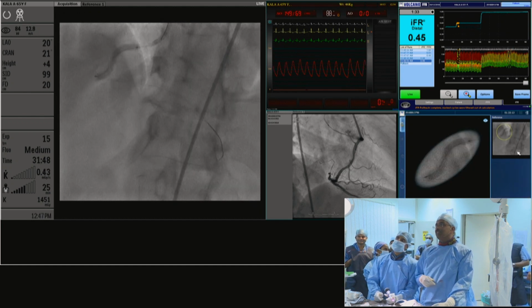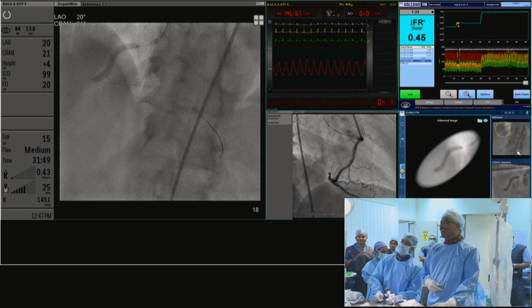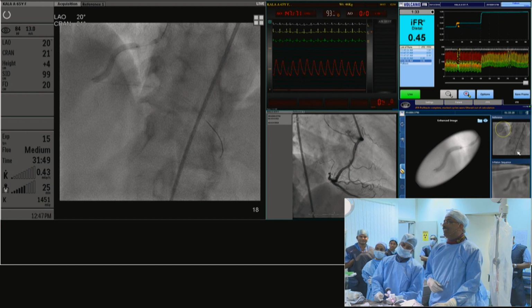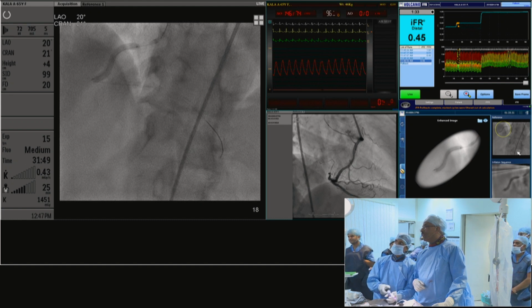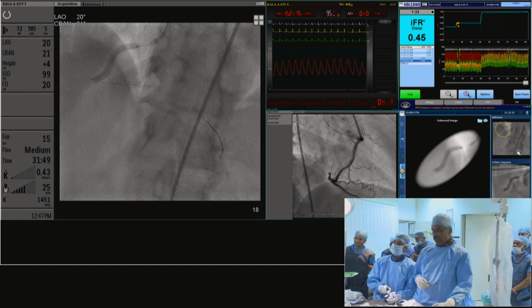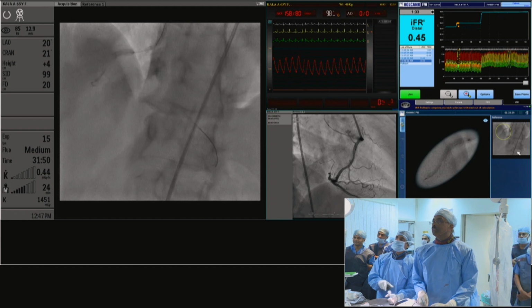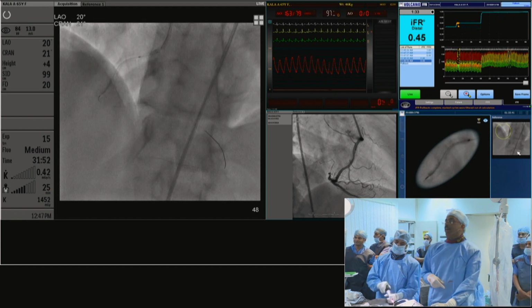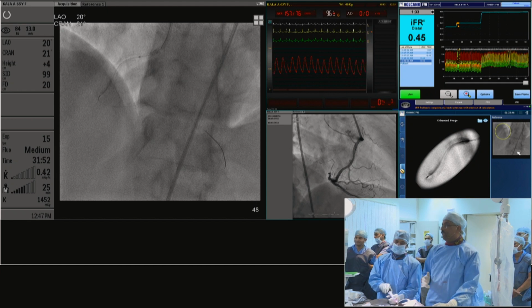So tell us more about that nice oval highlight picture that I see on your screen. Okay, you can get a dynamic balloon dilatation in the Philips. So we don't need to do cine. We can see it on fluoro. So you can really see the balloon is nicely opened up. That's called Angio Plus. Whatever you get with the cine, you get with the fluoroscopy, without taking a cine. So you don't need to cine.